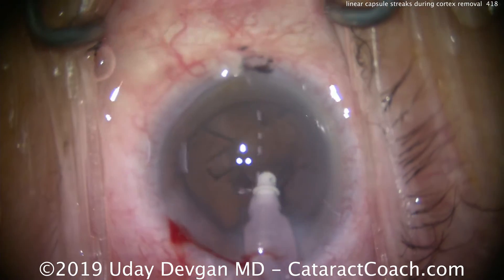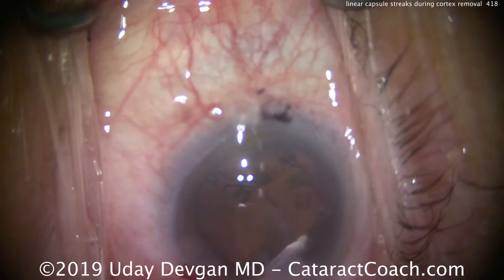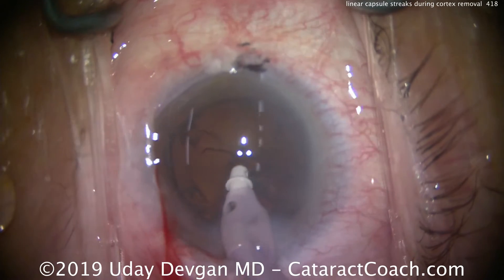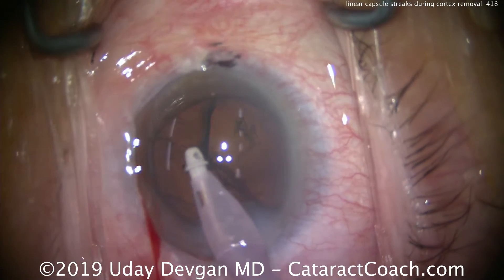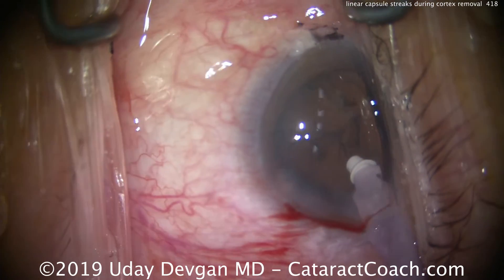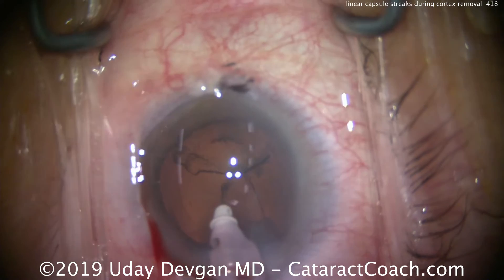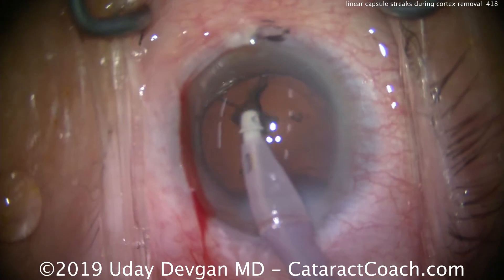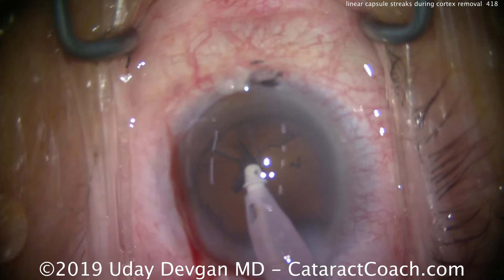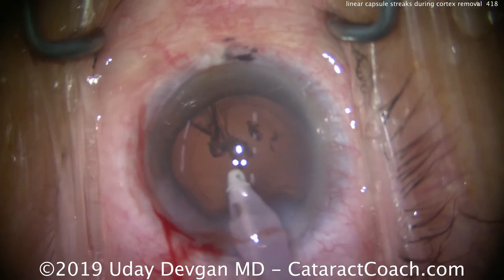Let's back-flush that. Let me let go and try a different spot. We go again very gently, just trying to get the cortex out little by little, just want to make sure there's going to be no issue with the capsule. Taking my time — watch now with this piece of lens cortex. That looks okay, but the next piece, as we pull on it, I'm a little hesitant. As I pull, it just strikes me as odd.